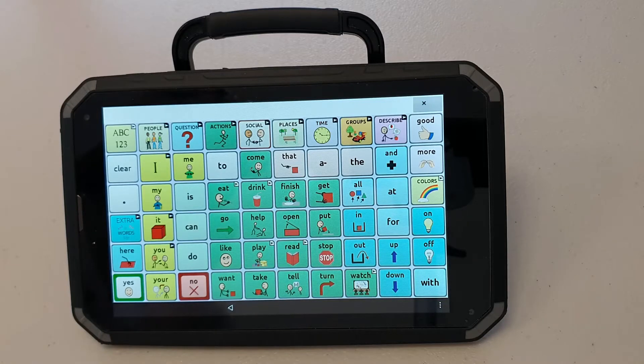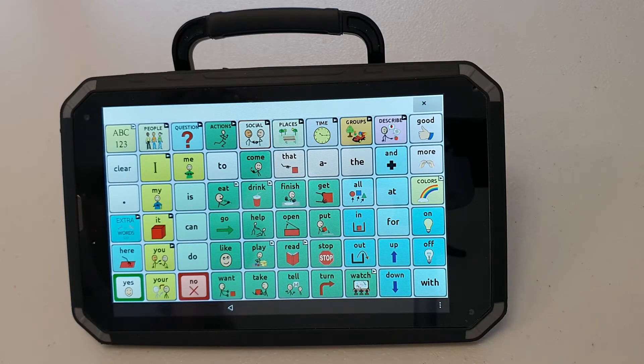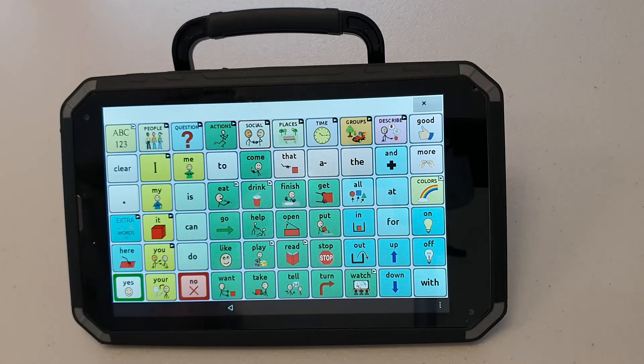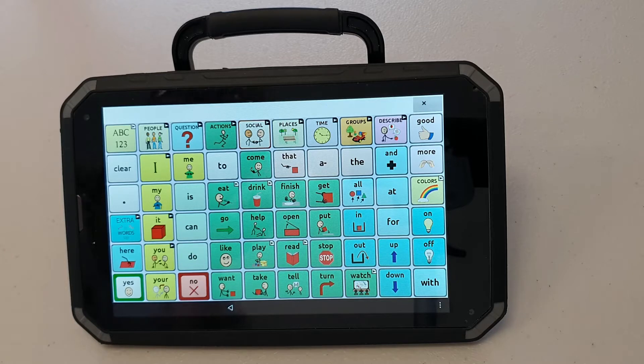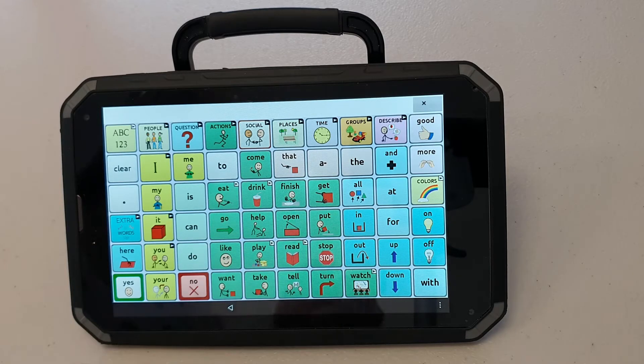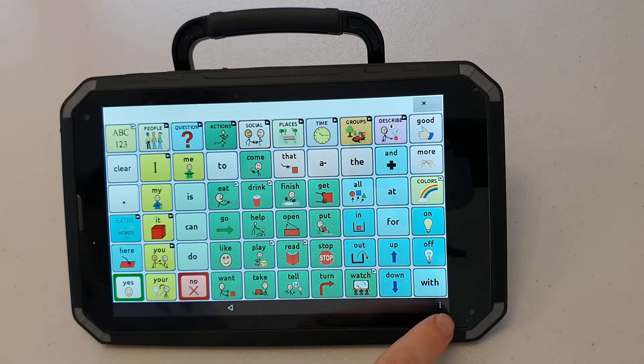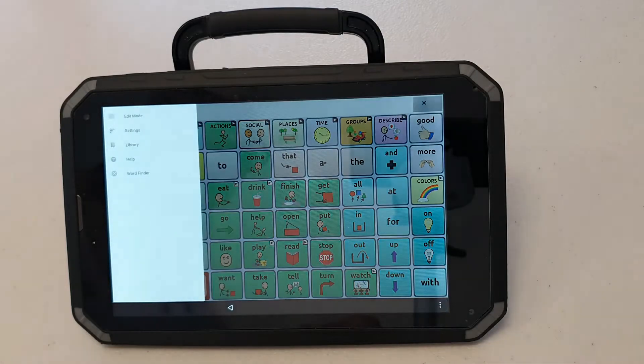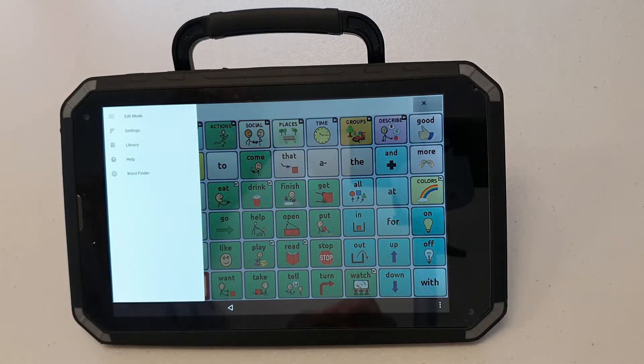We're going to set up the LR8 or the Liberator Rugged 8 device today. There are quite a few vocabulary files on this device at the moment. We have Word Power open but we're going to be looking at LAMP Words for Life today.